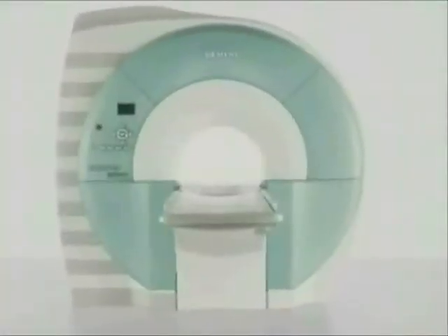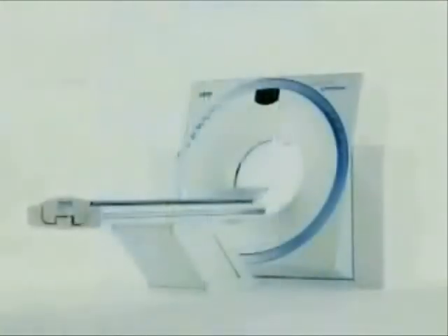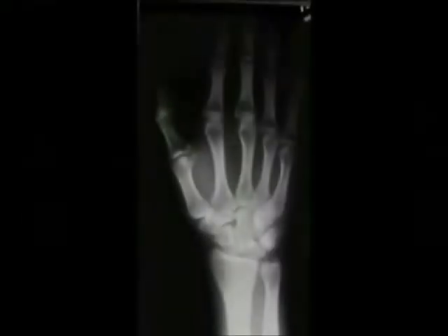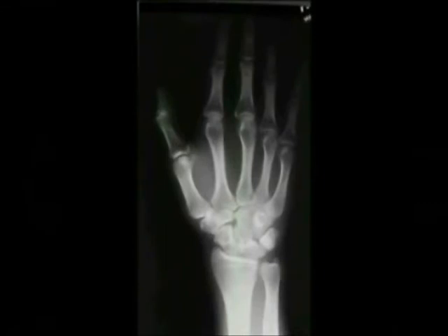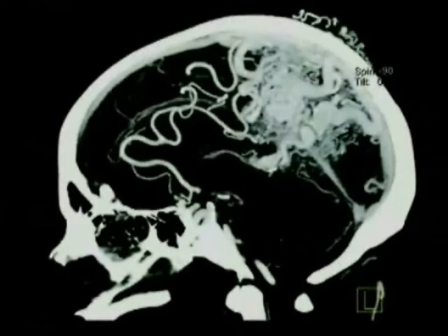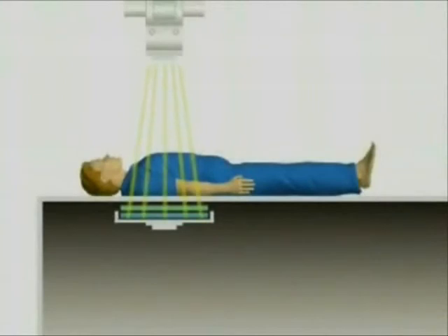Here's what makes MRI so different from other medical imaging techniques, such as conventional X-rays and computer tomography, known as CT scans. Let's see. X-ray devices are generally used to take projection images of hard tissues like bones. CT scans take images of both hard bone tissue and soft tissues such as the brain. Both X-ray and CT systems use X-ray beams which travel through the body and project an image onto photographic film or display it on a video monitor.